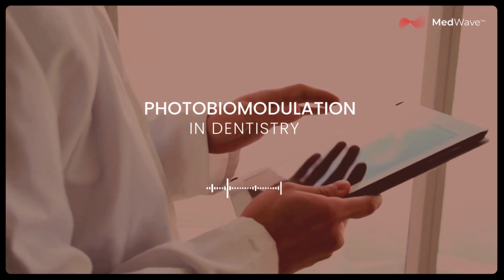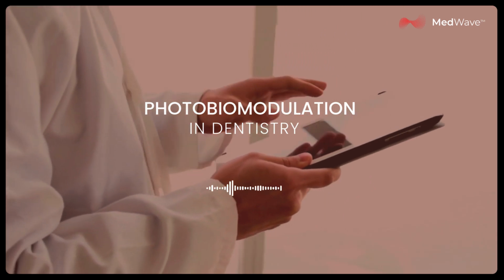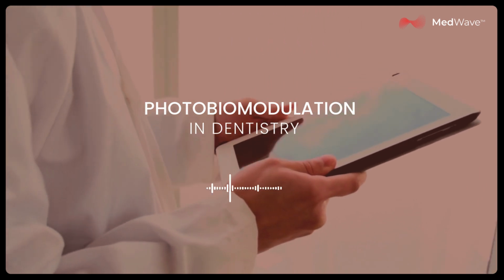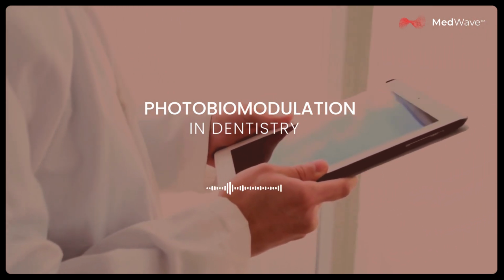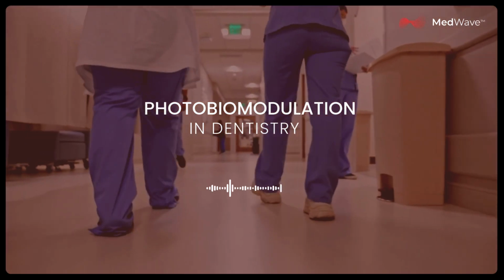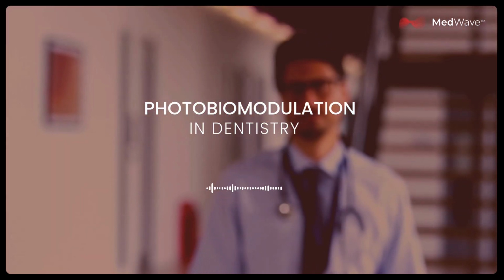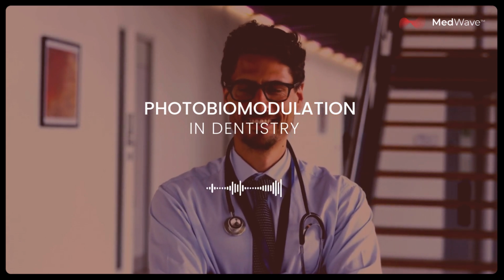Absolutely. What about long-term implications of using this? Are there any potential drawbacks or concerns that we should be aware of? That's an important question. And as with any new technology, it's essential to be cautious and consider potential risks. However, one of the most remarkable things about photobiomodulation is its safety profile. The wavelengths of light used are non-ionizing, meaning they don't damage DNA like some other forms of radiation. So it's a very gentle form of treatment. Exactly. And decades of research have shown that when used correctly, photobiomodulation has very few side effects. Of course, it's always best to consult with your dentist to determine if it's an appropriate treatment option for you.